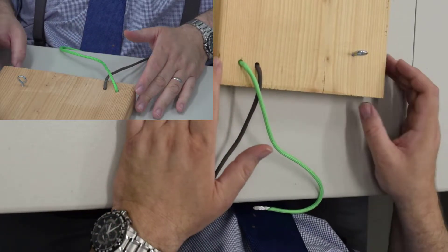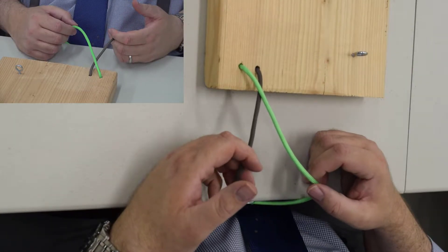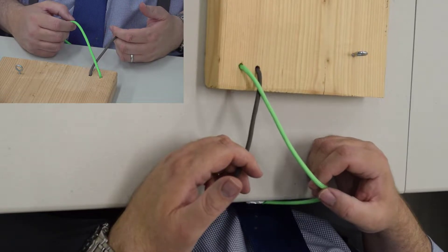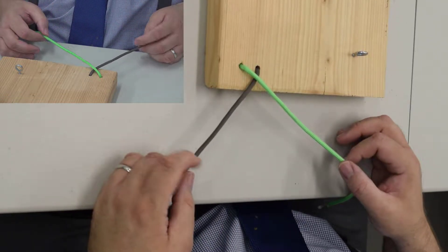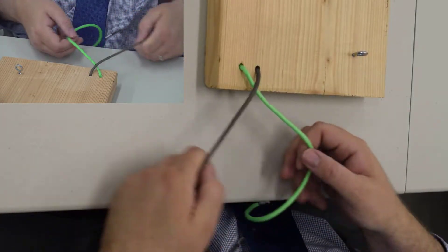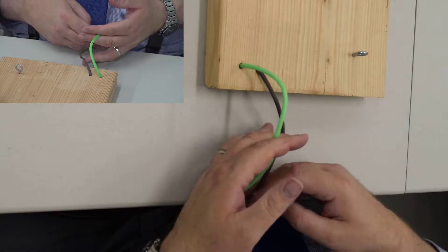So now I want to show you the two-handed tie. I mentioned in the previous segment that it matters whether you have the green over the brown. Let me show you why that is.